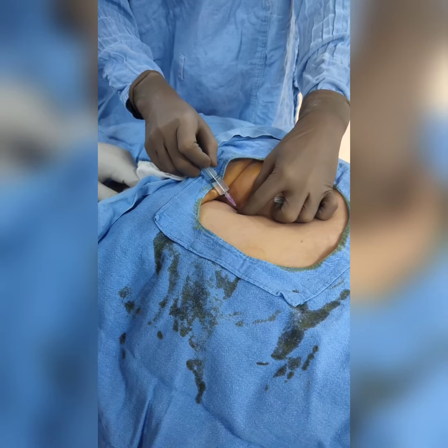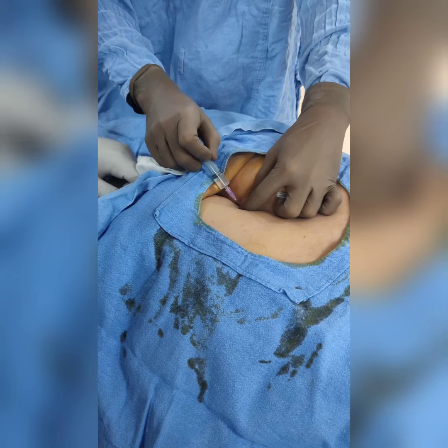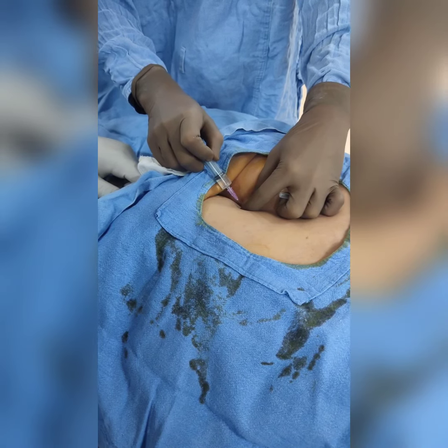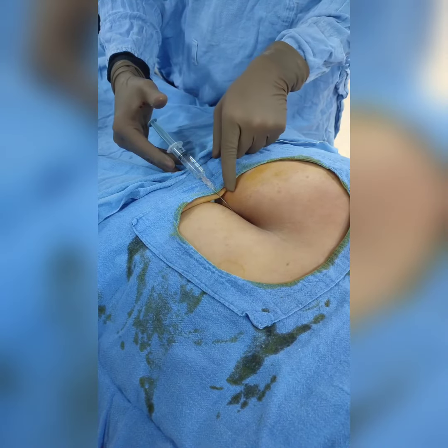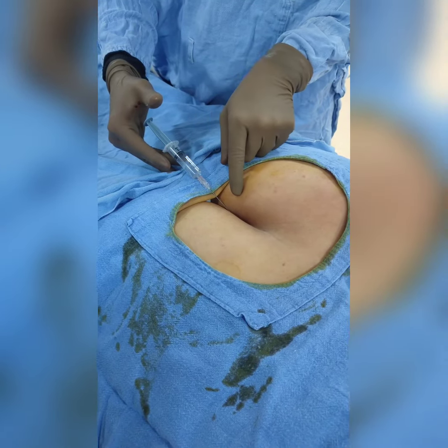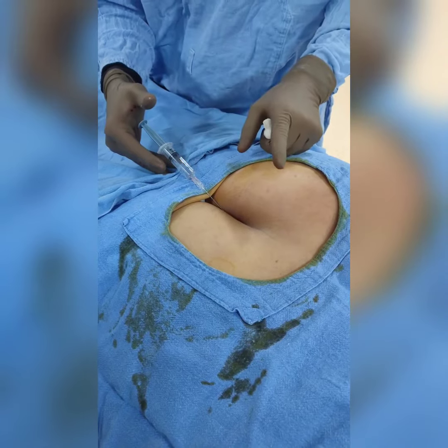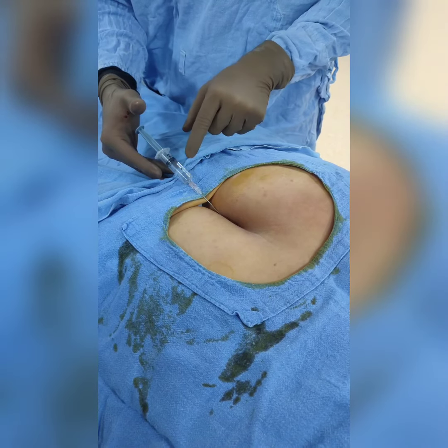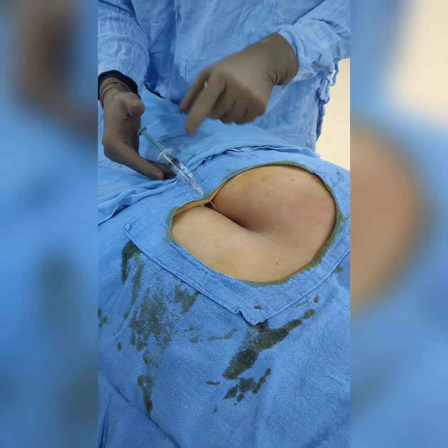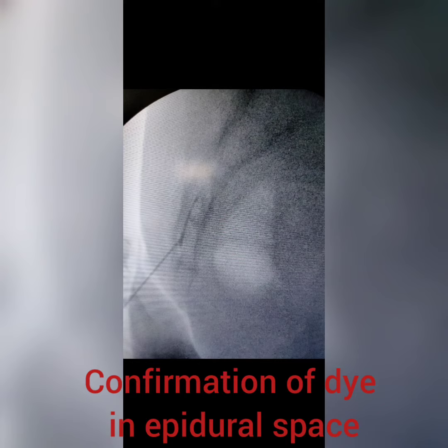I am giving lignocaine injection for local anesthesia. I have inserted the needle into the epidural space and confirmed it on the C-arm, and I have injected dye also.